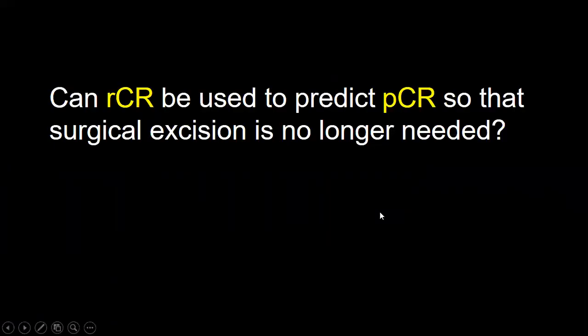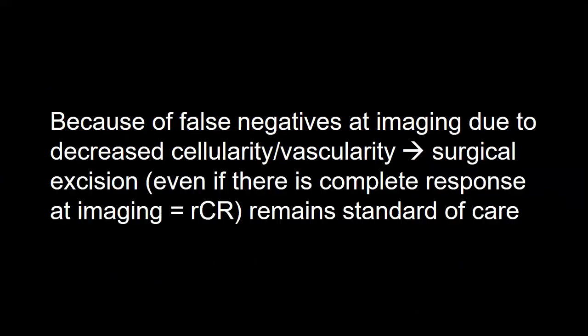Going back to our question, can RCR be used to predict PCR so that surgical excision is no longer needed? Well, at this time, not so much because of false negatives at imaging due to decreased cellularity or vascularity. So surgical excision is indicated, even if there is complete response at imaging, even if you have RCR. That is still the standard of care.